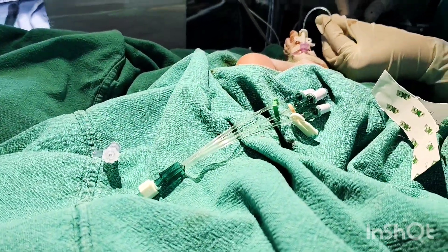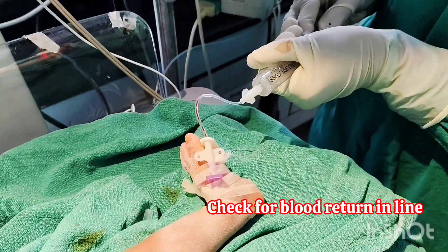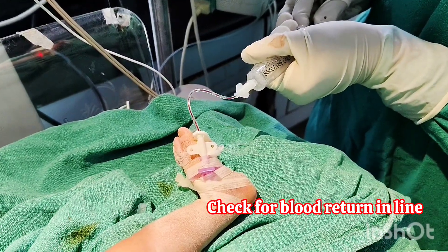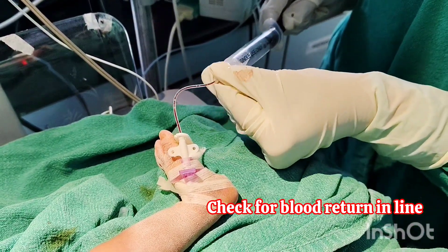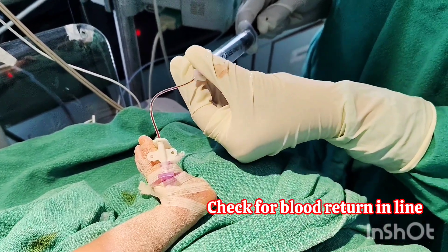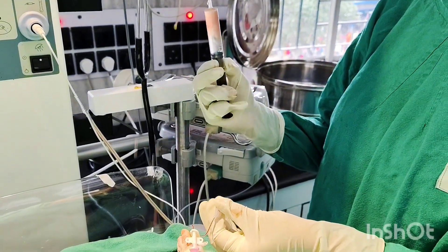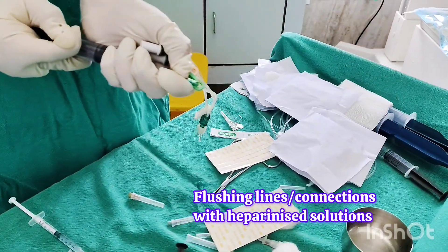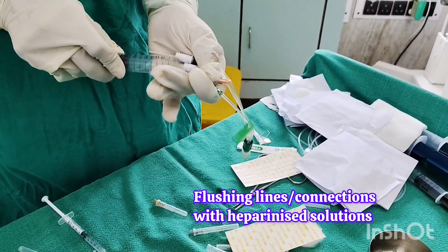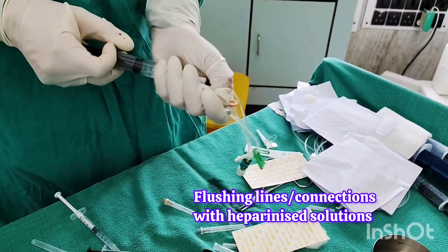Always check for blood return before using the line to ensure it is working correctly. If you cannot get blood return, a small amount of saline can be instilled to try and clear the line. All extension lines attached to the PICC line should be flushed with heparin to prevent formation of blood clots and blockage.